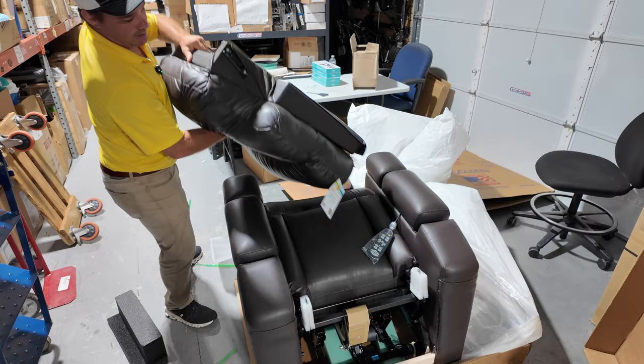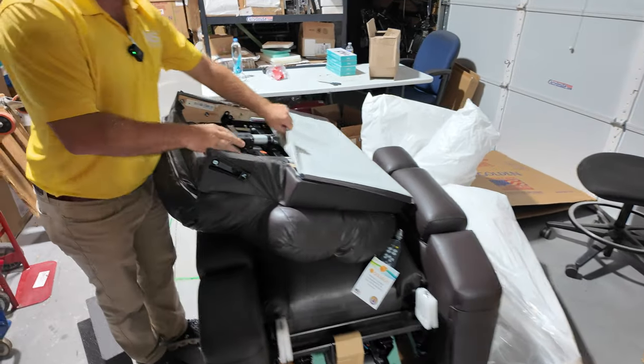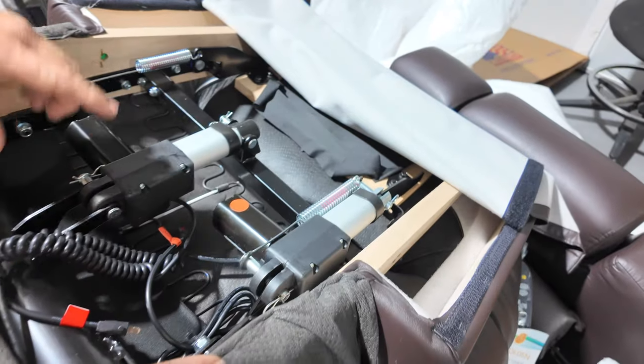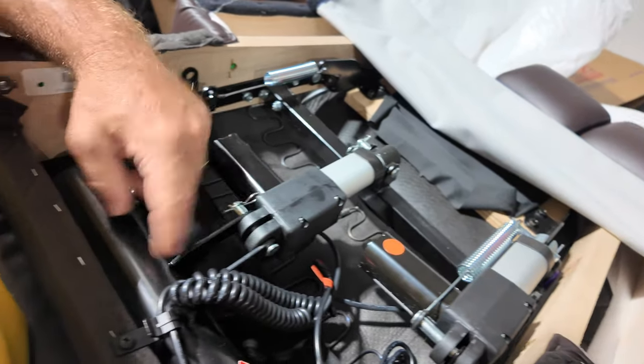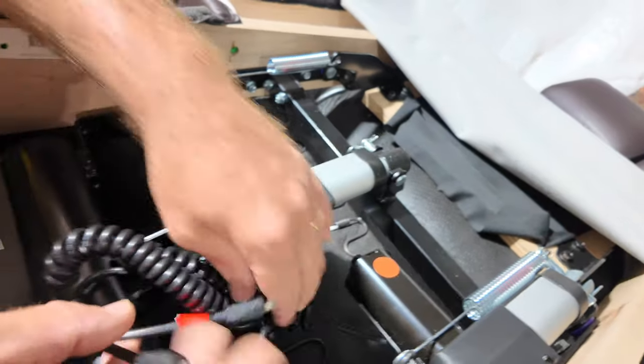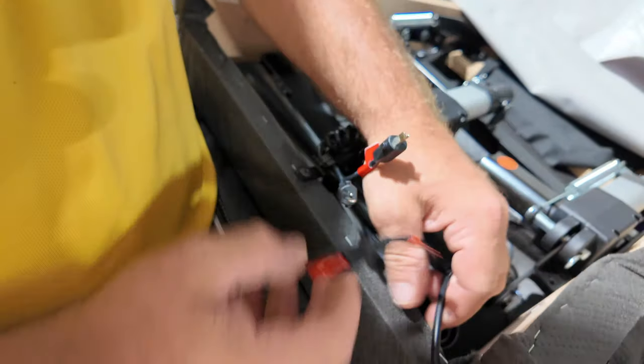Here you go — these are the motors, and that's an improvement. This is your lumbar and this is your power pillow motor. You're going to see the connections — everything's plug and play.